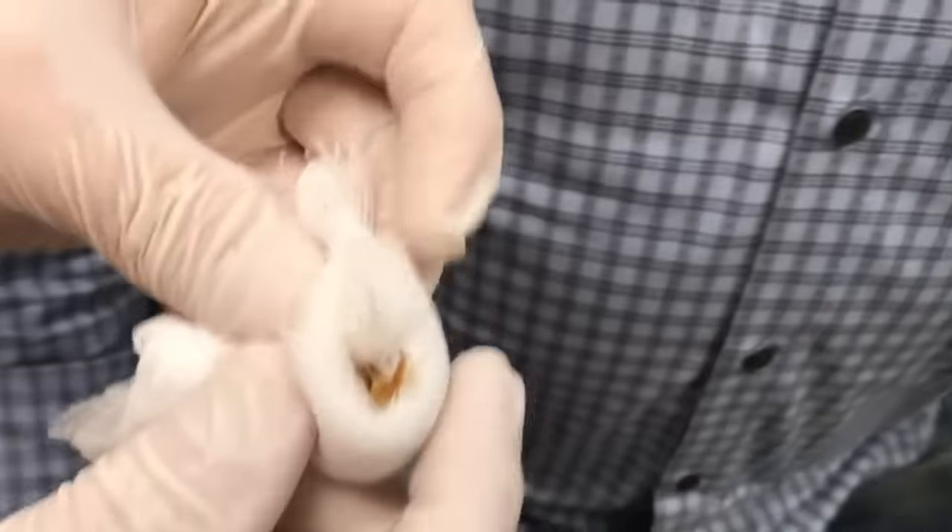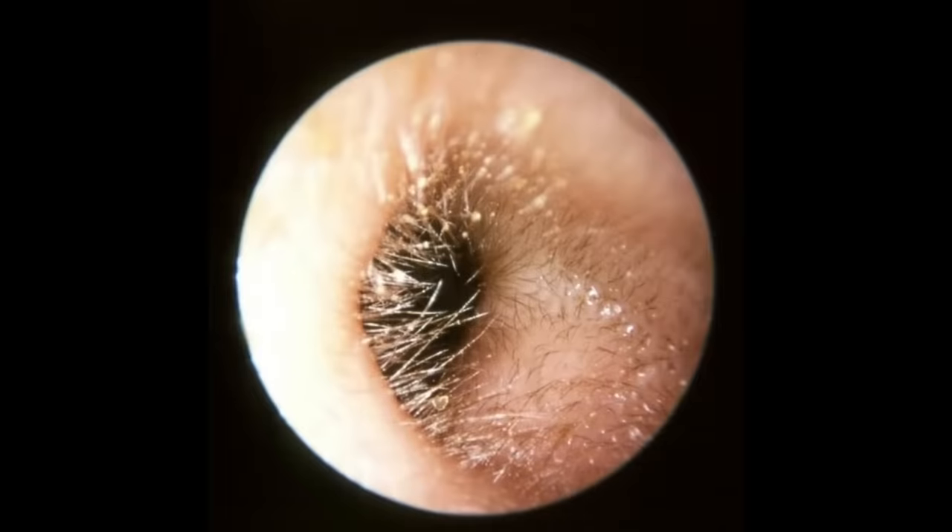What happens is it gets in there and it'll dry, and it sort of attaches to the little hairs inside the ear canal. So when we scoop it out, it tears those little hairs out and it hurts a little bit.